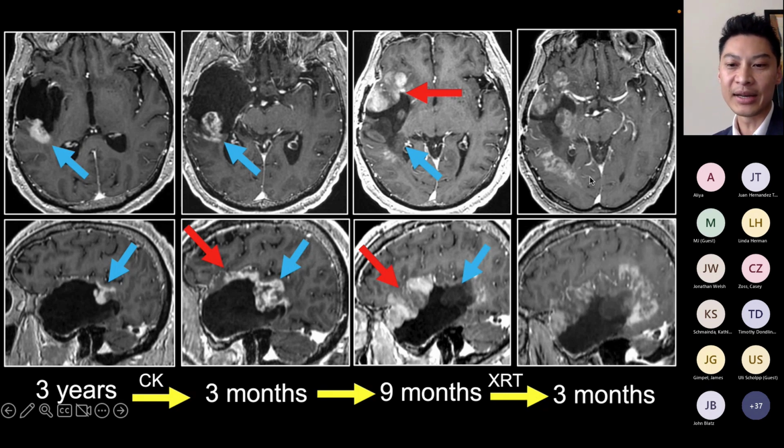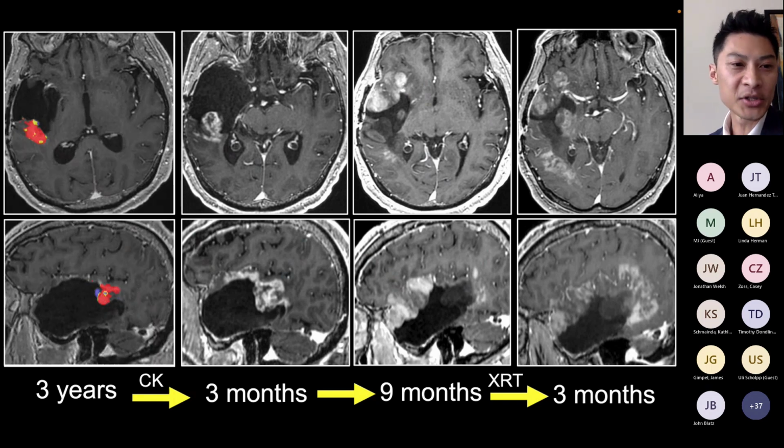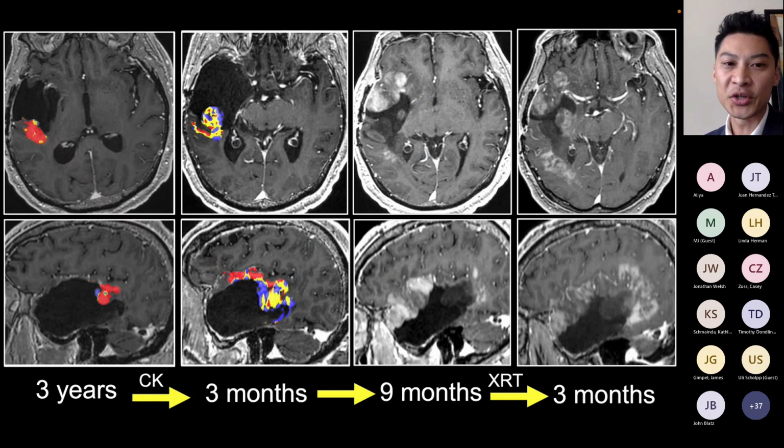So what's going on? Again, a little hard to know, but one would probably think that this is all tumor progression. So let's see how the addition of perfusion imaging can be helpful in this particular case. Okay, so I'm going to show you the fractional tumor burden map, predominantly red voxels. So looks like tumor. So this was CyberKnifed, underwent stereotactic radiosurgery, and we noticed that the perfusion of that lesion decreased. So in fact, this was predictive of treatment effect.